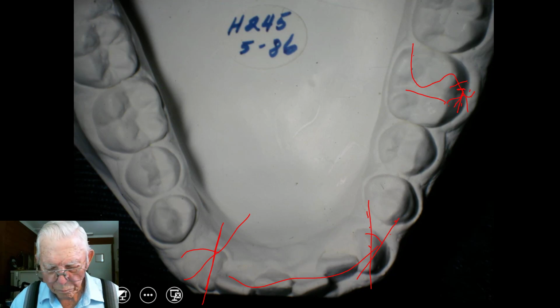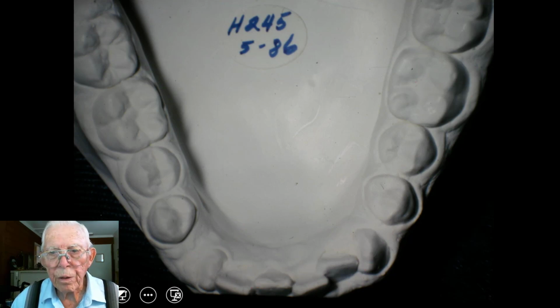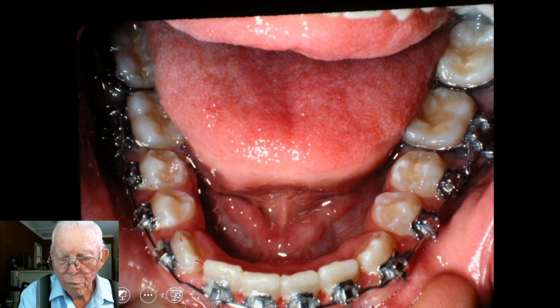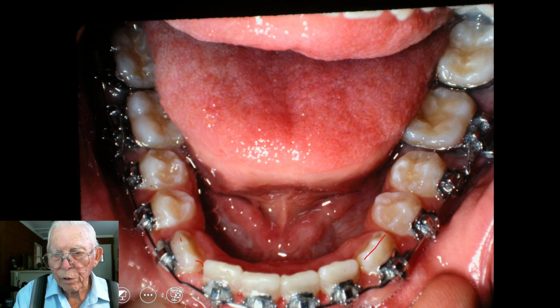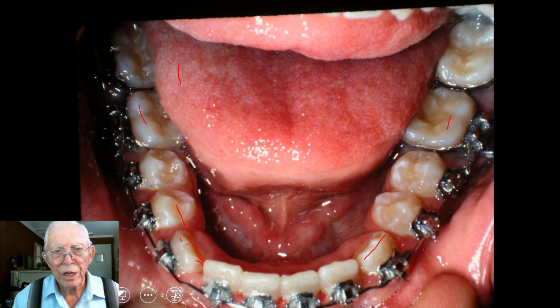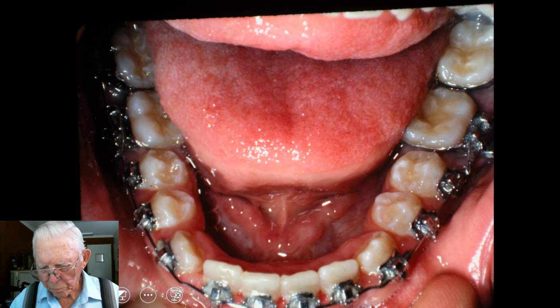All right, we'll go on to look at the difference in this lower arch now. And you see we've got this rotated almost all the way. Neither one of them are completely rotated, but we've lined this up. Now that other picture going straight back in here was kind of a defective camera position. And here is the young man, but this is just like we started with him.